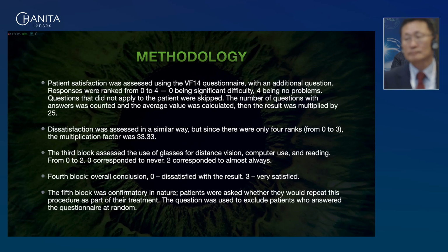The third block assessed spectacle use for distance, computer and reading, from 0 to 2, from never to almost always. The fourth block gave the overall conclusion, 0 dissatisfied, 3 very satisfied. The fifth block was confirmatory. Patients were asked whether they would repeat the procedure as part of treatment. This question was used to exclude responses from those who answered the questionnaire at random.